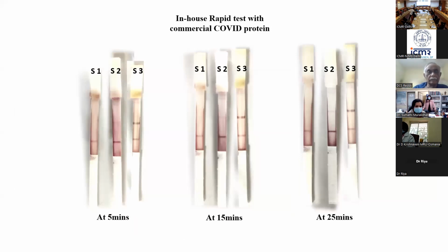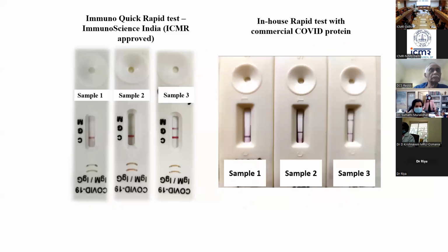So everything, we cut the strips. It's like a China market where you cut it yourself, you stick it yourself. Everything is done manually. And once this is in, then you try making it in cassettes. And over here at this point, you do your internal validation, external validation. You can see the difference of how a beautiful kit by a company looks and how an academic kit looks, but that is fine. In the end, we are going to give it to a company who would be beautifying everything.